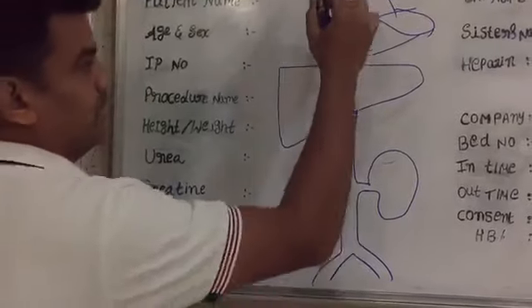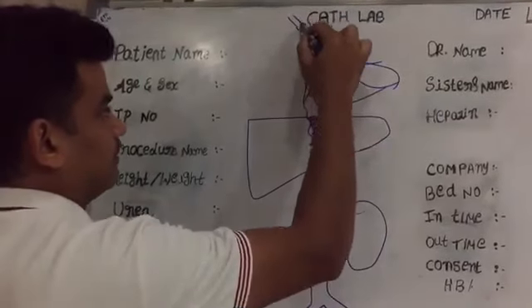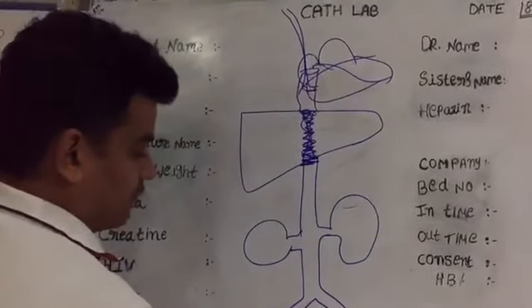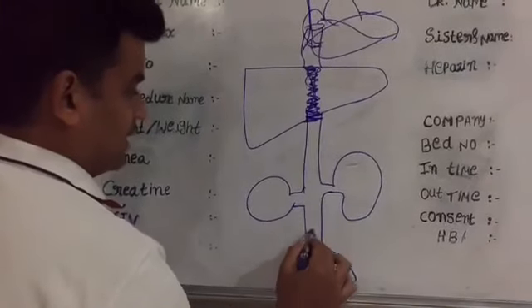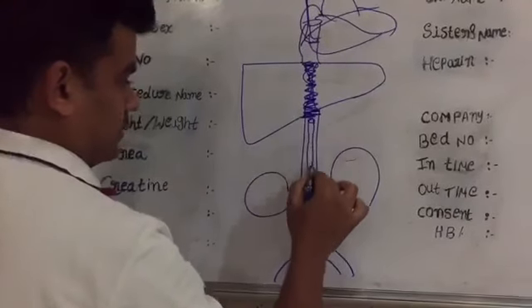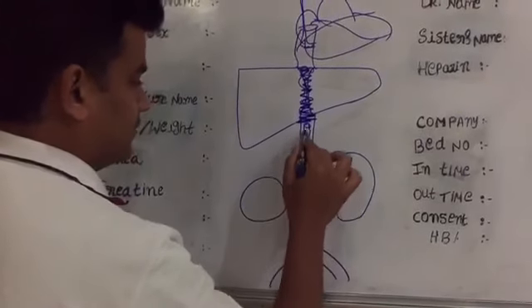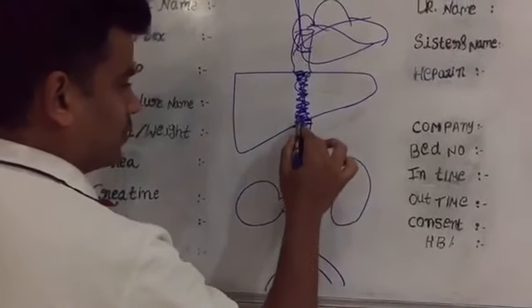So what we do is we take a catheter and we put it as a guide over here. It is sitting over here all the time. Now we take an 11 French sheath here, and then we take about a 10 French long sheath, and within that we take a bevel needle, and within that bevel needle we take a Chiba.